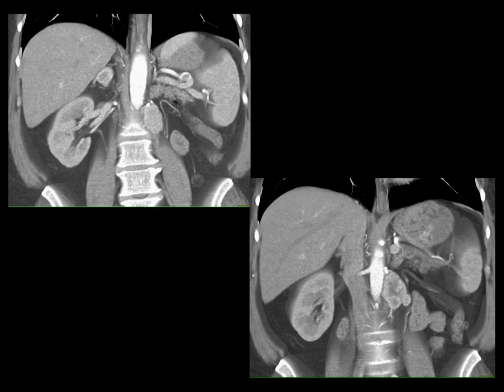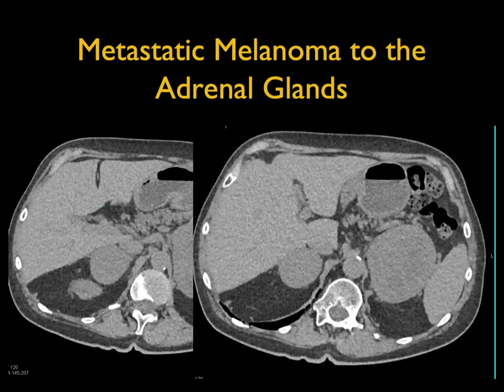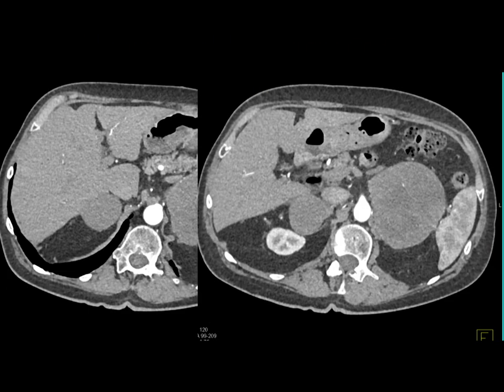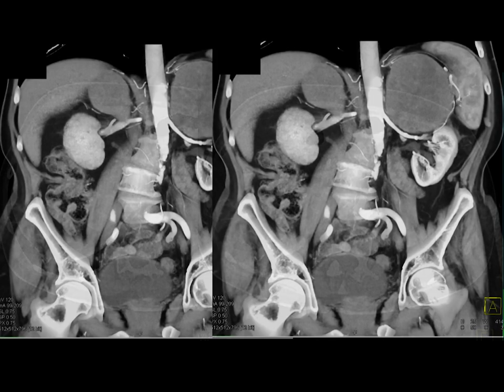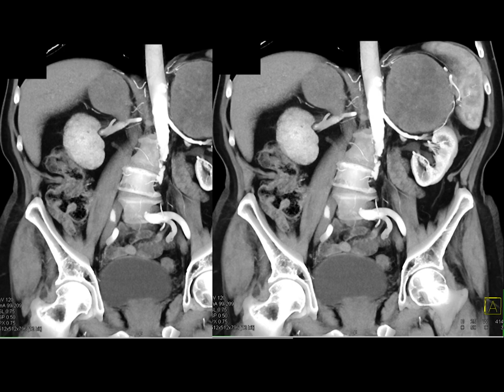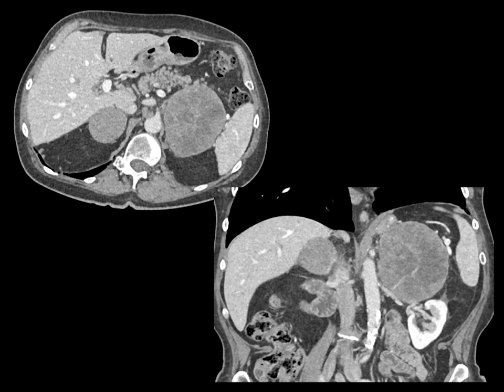Looking at renal cell metastases — here's a good example showing mets to the right adrenal that are vascular, and also mets to the periaortic region that are also vascular. One classic teaching point: when you see vascular nodes or a vascular adrenal lesion, you better be thinking about renal cell. It's typically not going to be papillary renal cell carcinoma — it's going to be clear cell renal cell carcinoma.